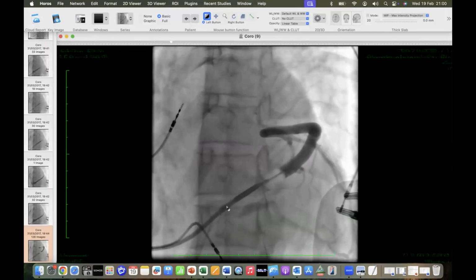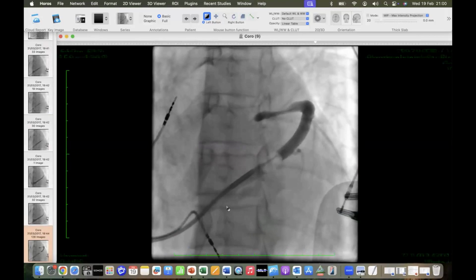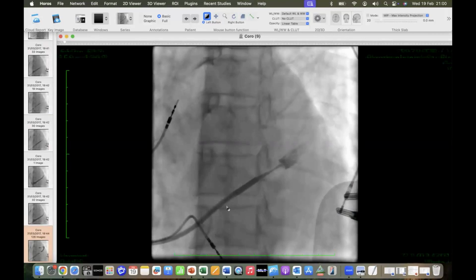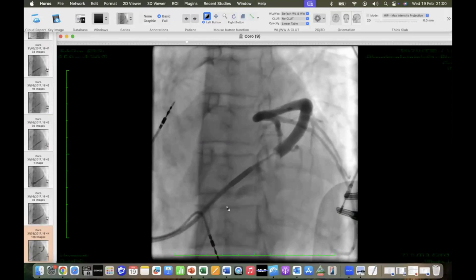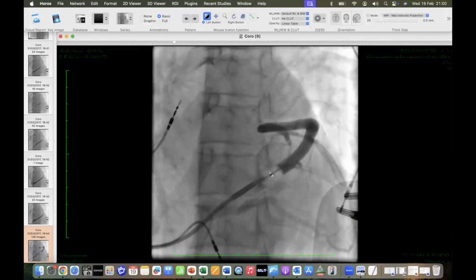So what I did was I took a balloon venogram, I inflated a balloon over here, and I took a bunch of pictures. And then as Hasham demonstrated, I then deflated it. I'm just going to pause it over here to demonstrate what's happening with a balloon venogram. The balloon is inflated. We can now put a good amount of positive flow.